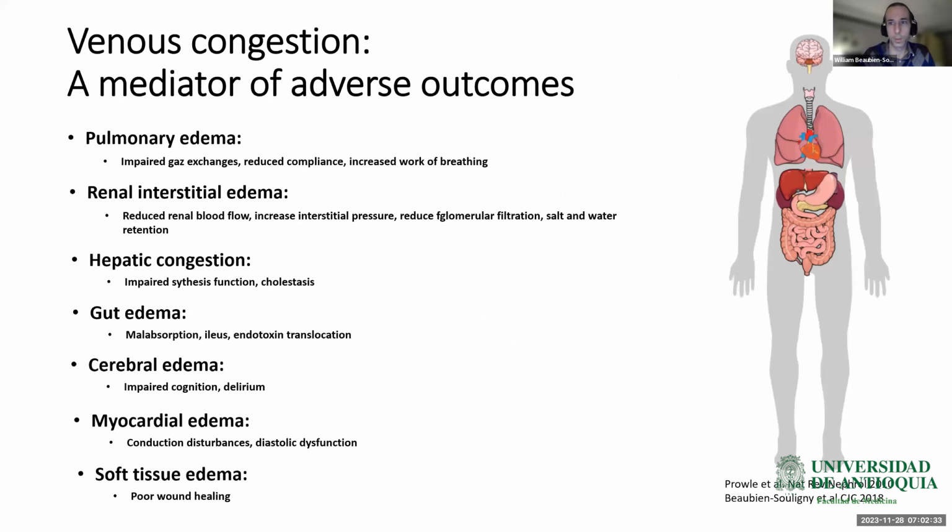So in this presentation, we'll focus more on the importance of venous Doppler in the assessment of heart failure. And as you know, the venous circulation is different from the arterial circulation. The venous circulation is high compliance and high capacitance, a low resistance circulation, and it has a non-pulsatile flow.